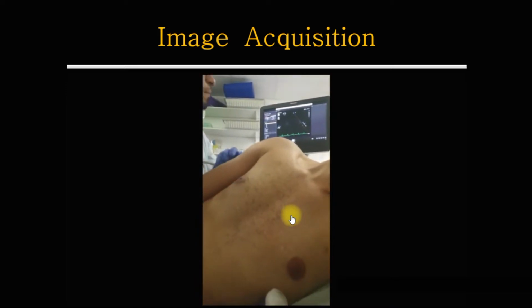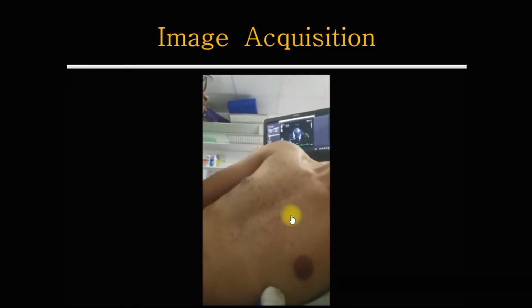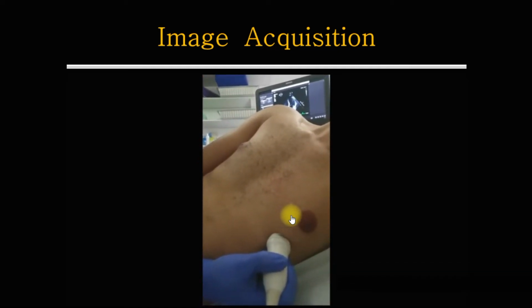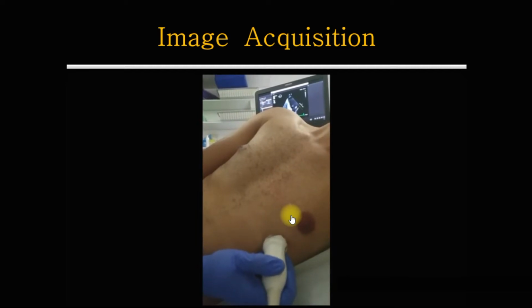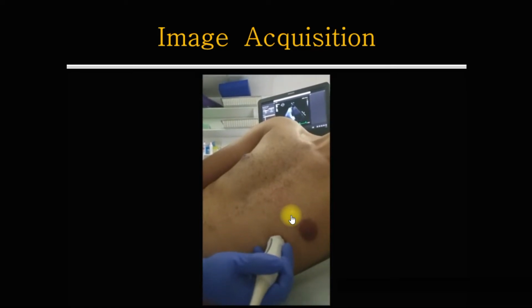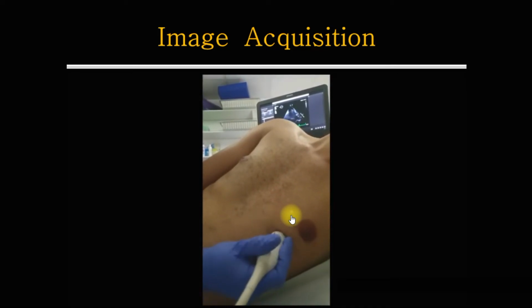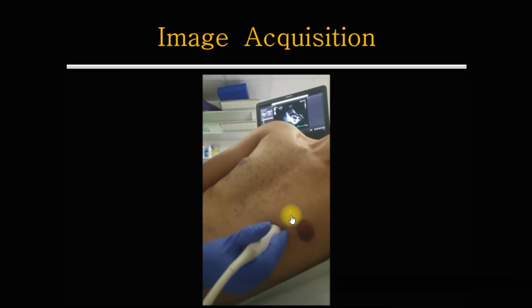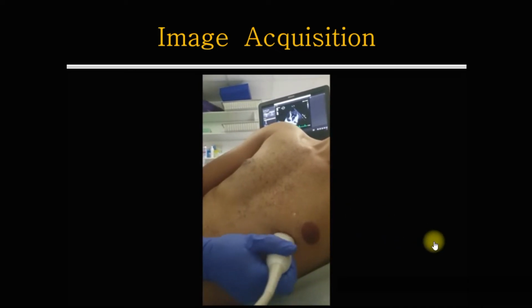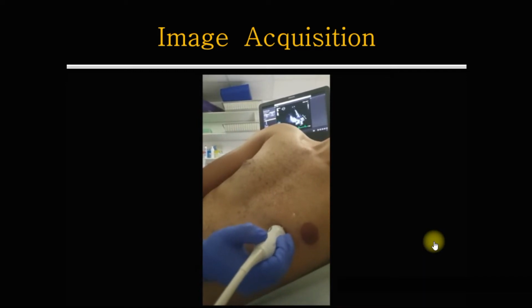Then what we wanted to see is the apical view. The marker should be pointing toward 2 to 4 o'clock, apical 4, then 12 o'clock, apical 2, further rotation, we can get around 10 o'clock the apical 3-chamber view. One more time, 2 to 4 o'clock, apical 4, apical 2, 12 o'clock, 10 o'clock, apical 3-chamber view.